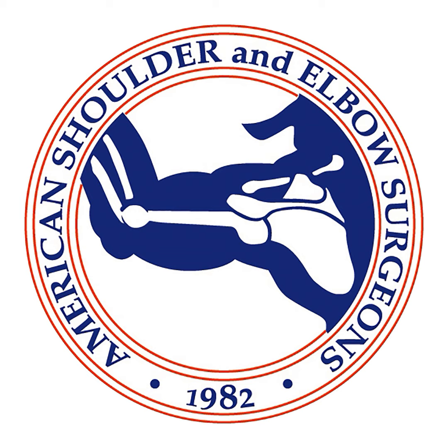It's interesting. Just as a segue to that, I would say, Pete, a number of us still like to do anatomic total shoulders in our practice, even in expanded ages. Last week I did a stemless anatomic in an 83-year-old woman. She had a great quality cuff and minimal glenoid bone loss, and you put a stemless implant in there, you get great fixation, and over time you realize that you can get great fixation with these types of implants and the durability that's been shown in the literature. So I think we've expanded even our indications on stemless now, perhaps beyond what they were a few years ago. And it sounds like Mike's experience has been similar to mine, that over 98% of the anatomics he's doing now are stemless, similar to myself.